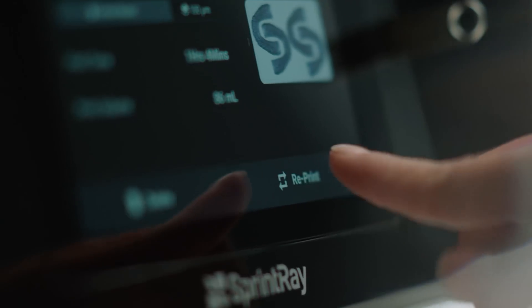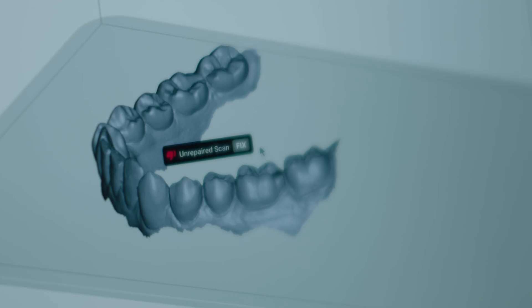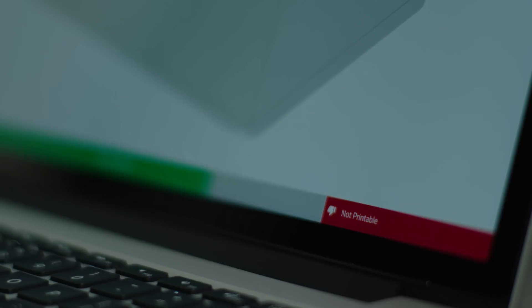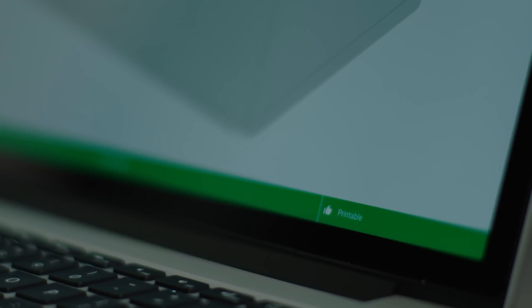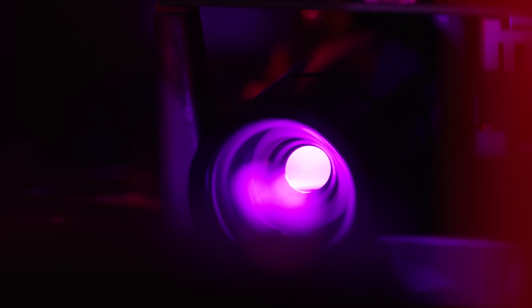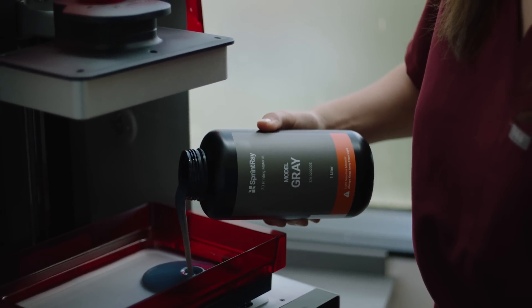3D printing makes this possible and it's never been easier than with Sprint Ray Pro. Your practice will love the incredible capacity that Sprint Ray's custom DLP projector, resin tank, and platform provides.